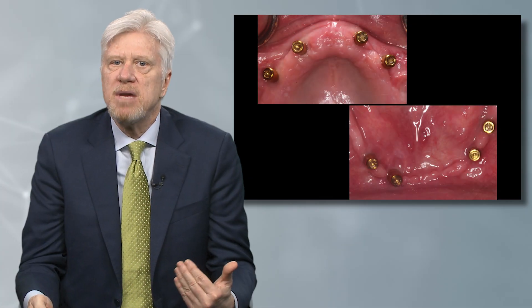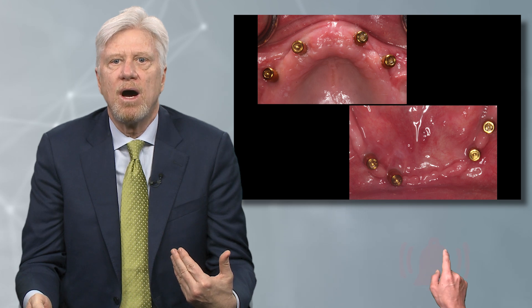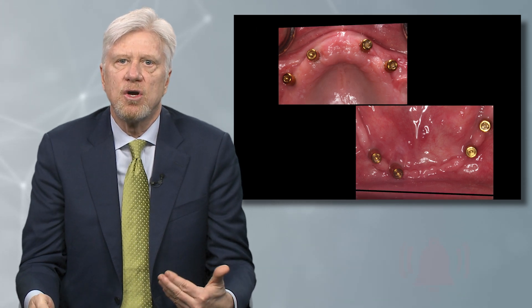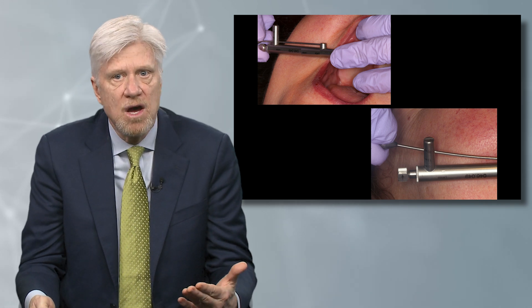We torque the implants into position, and you can see that the AP spread is going to allow a real nice functional overdenture. We're torquing them to 30 newton centimeters, which will eliminate any rotation.